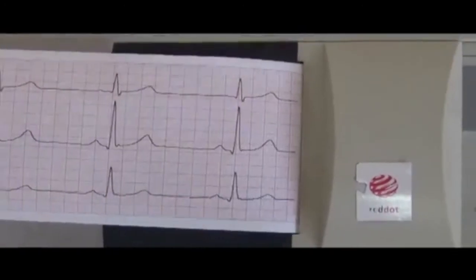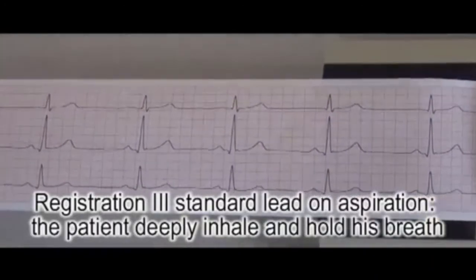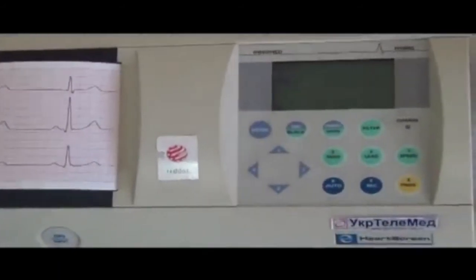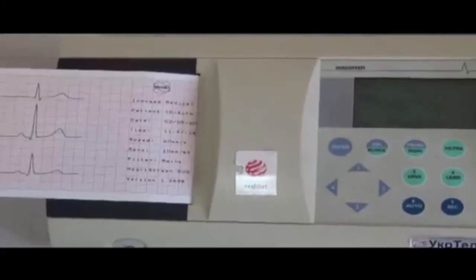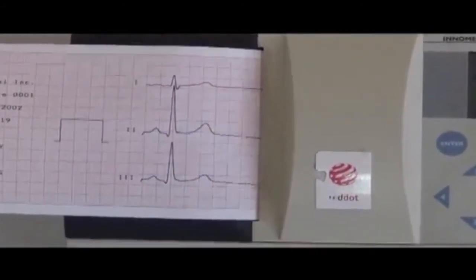Turn off the tape. Remember that the third standard lead should be registered on inspiration. For this, ask the patient to take a deep breath and hold it. Record two or three complexes during breath-hold.